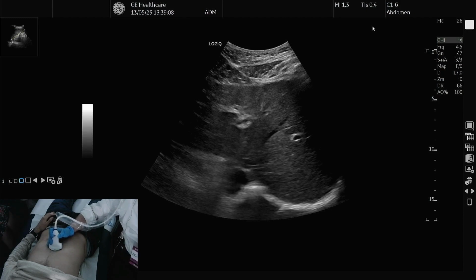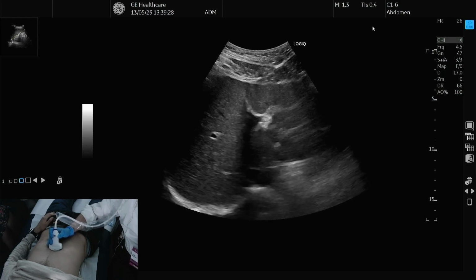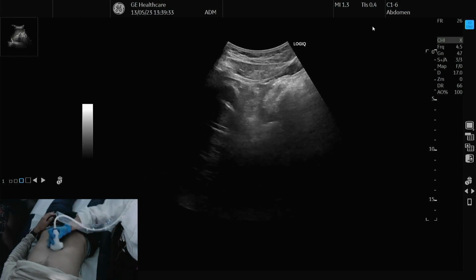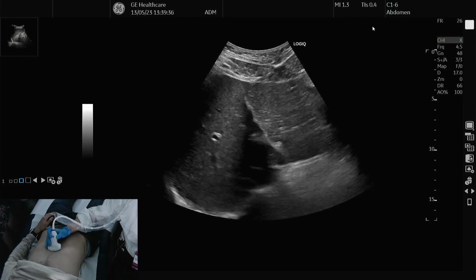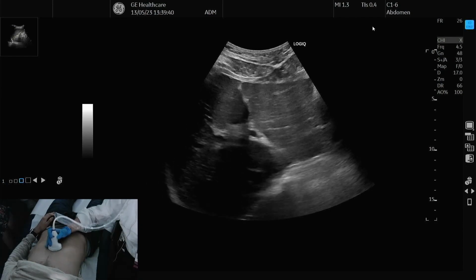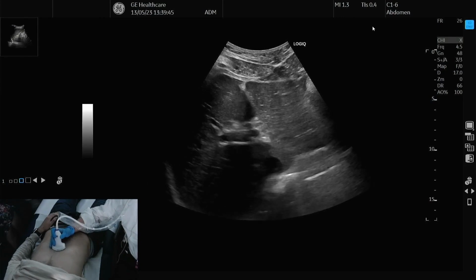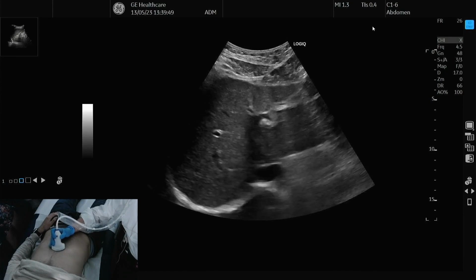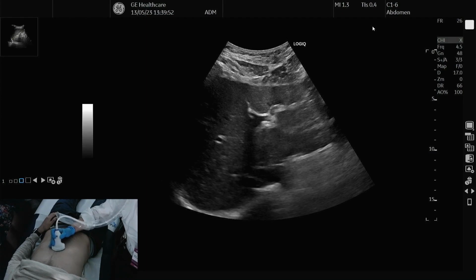Either I use the key on the display and have it reversed electronically, or I flip the transducer. Right, at this point we're on the conventional image, so to speak. In most subjects we get the liver image with the left lobe of the liver, the falciform ligament, and that continues with the ligamentum venosum of Arantius, the right lobe aspect, and the left lobe aspect, on this section having a somewhat triangular image. That is, the ratio of the right lobe to the left lobe is somewhat 2:1.